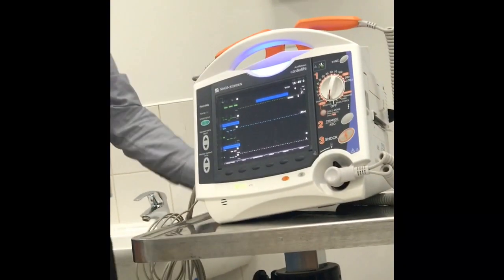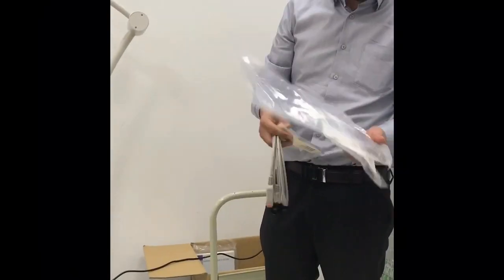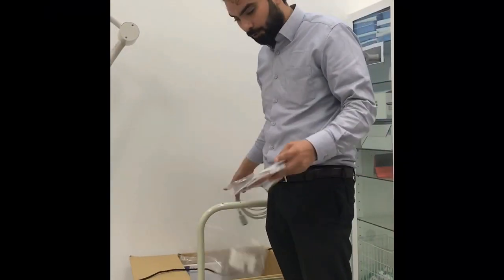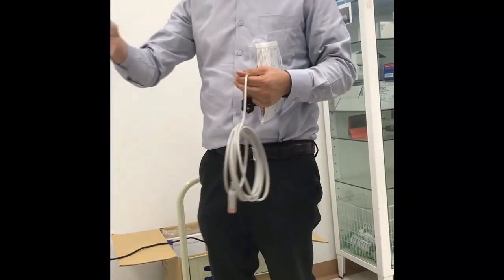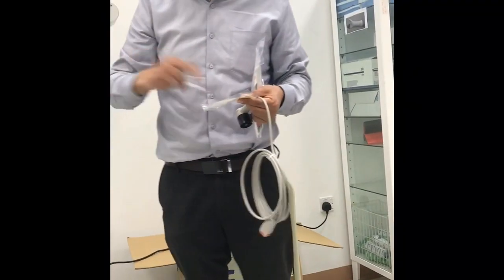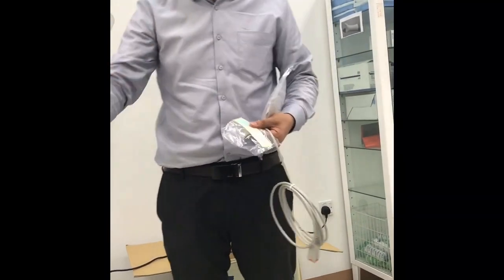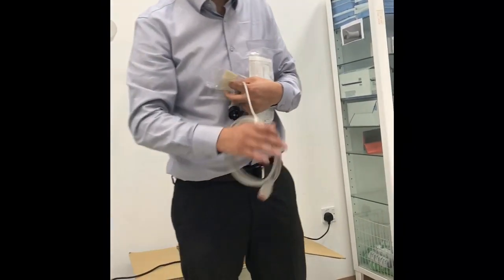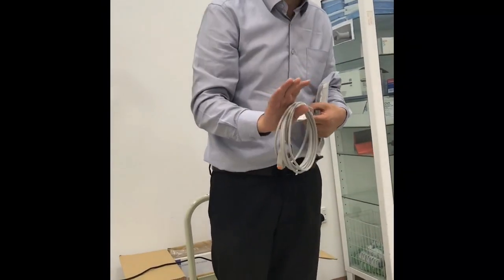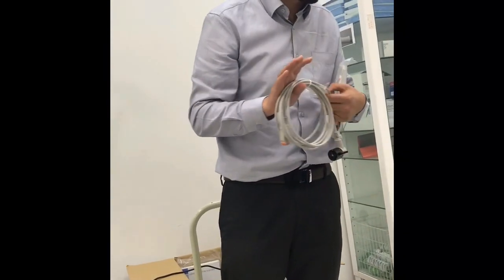This is a cable for AED pads. We have a label with each cable showing when we install it, so we can mention here the date of installation. We recommend changing it every 2 years. We recommend changing the cable every 2 years, okay? If you don't need to change it, it's fine. But as a manufacturer we recommend changing it every 2 years to be sure. This cable is for what? AED pads.